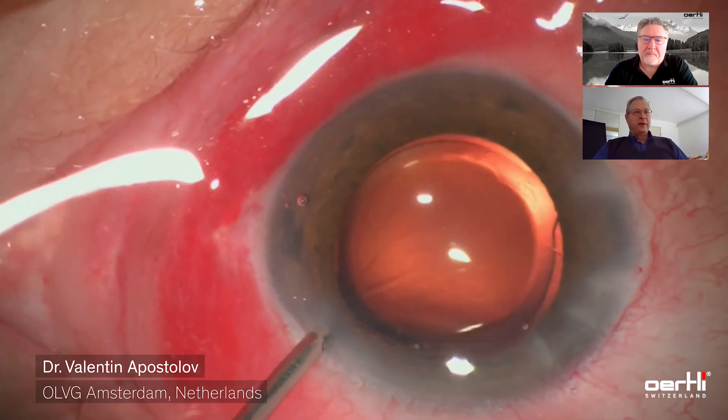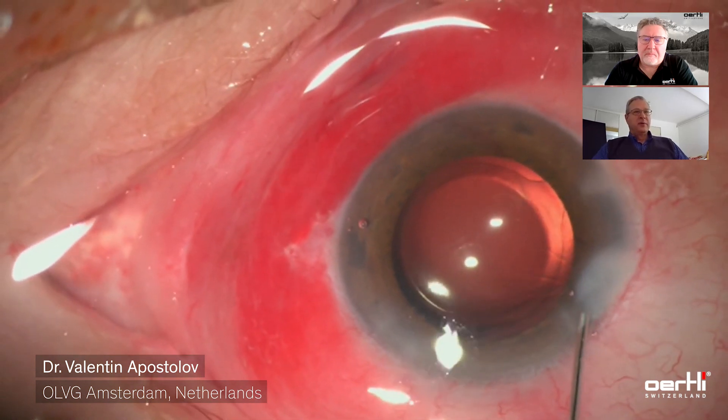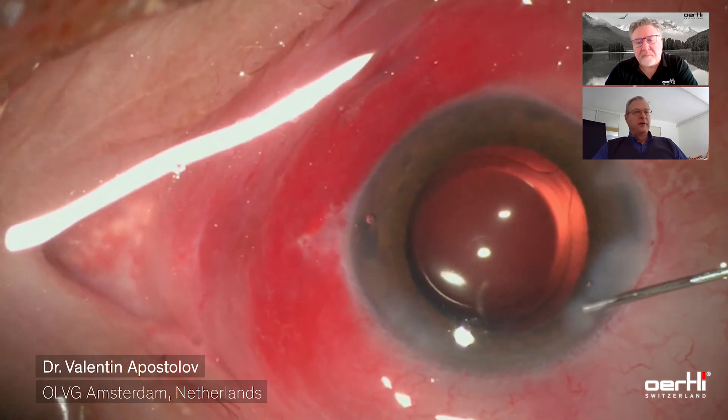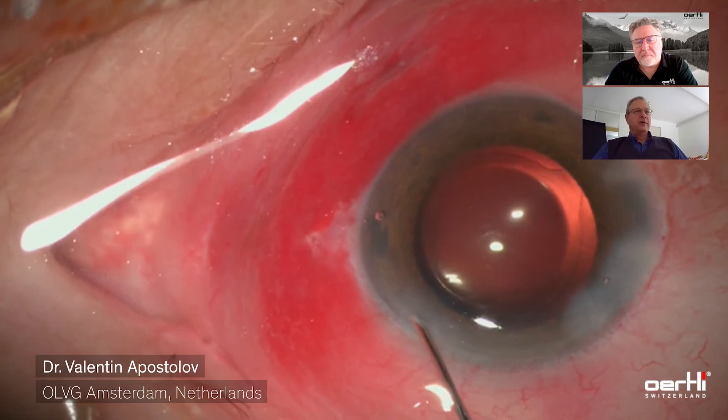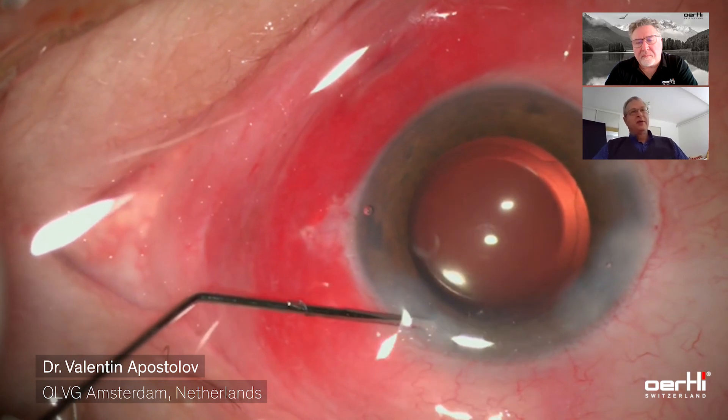Now the incisions are being hydrated. I absolutely don't take any chances with leaking wound leakage or the possibility of something getting inside the eye from the outside. So I take the time to hydrate the incisions and always check in the end if the eye pressure is normal or a bit higher than normal. You can see that after a moment I check the eye pressure with the cannula.